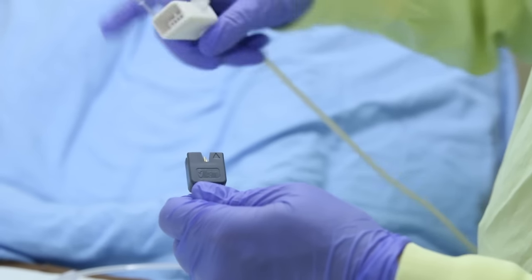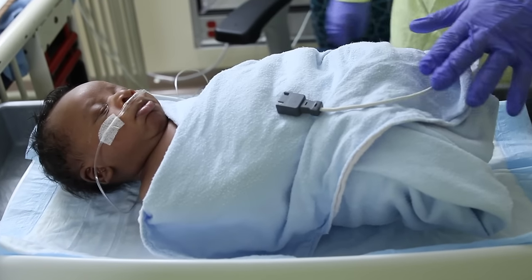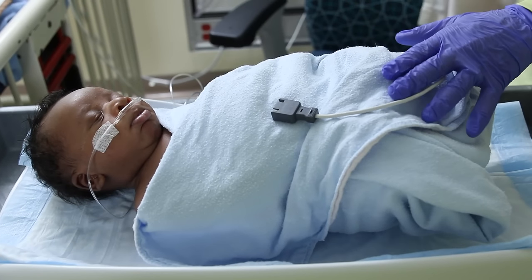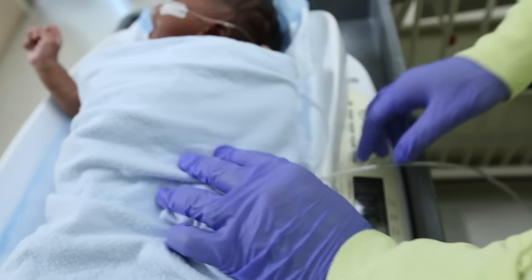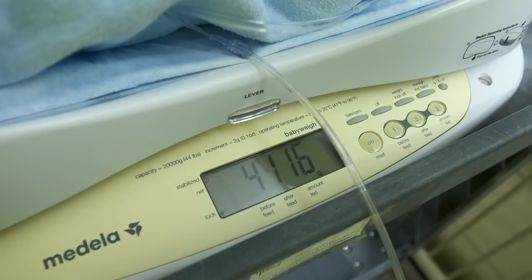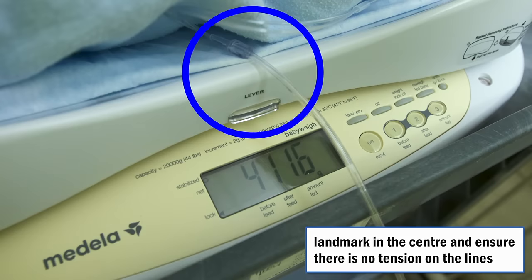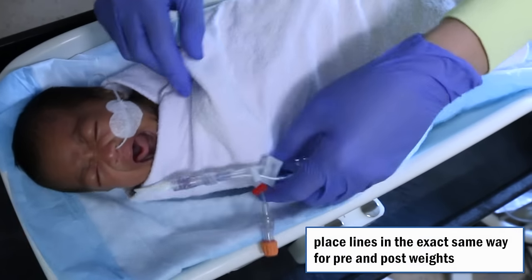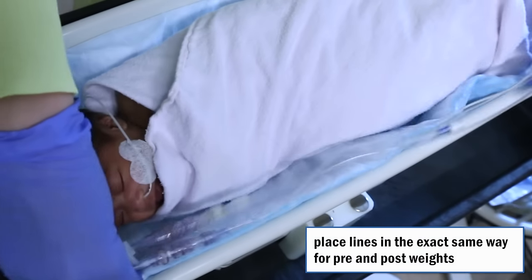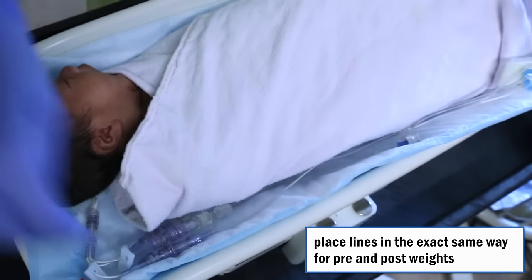If the infant has leads or lines, disconnect any leads that can be disconnected briefly for the weights, such as the heart monitor. Silence the alarms and place the remaining leads attached to the baby completely on the scale with the baby. For lines that cannot be disconnected, place the heaviest portion under the infant's bottom and have the remaining portion hang off the side of the scale loosely in a precise location so that it may be replicated for the post weight. Have it hang over the center of the front of the scale to help with landmarking. Ensure there is no tension on the hanging portion of the lines. The most important aspect is to place the lines the exact same way for the post weight as for the pre-weight.